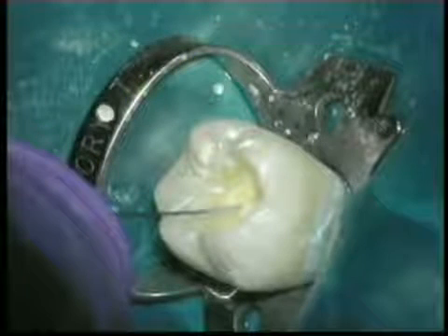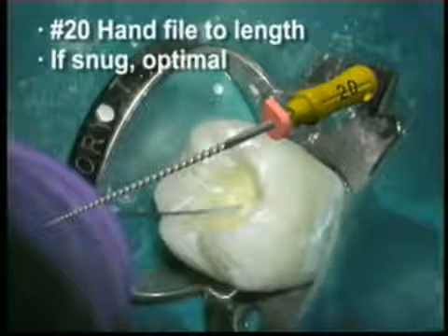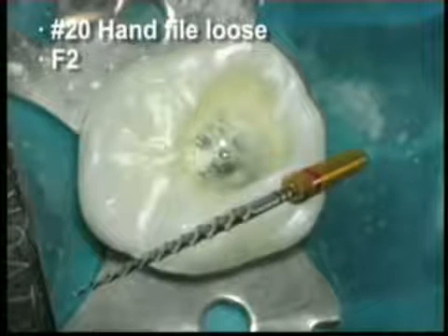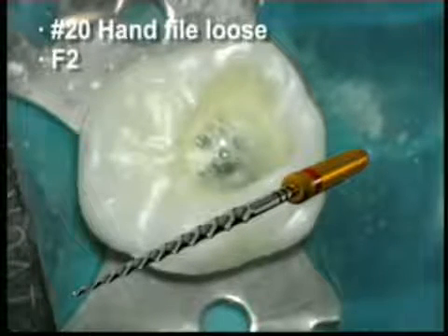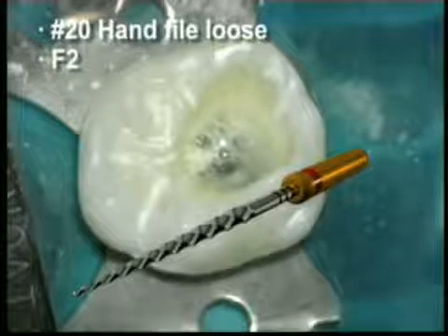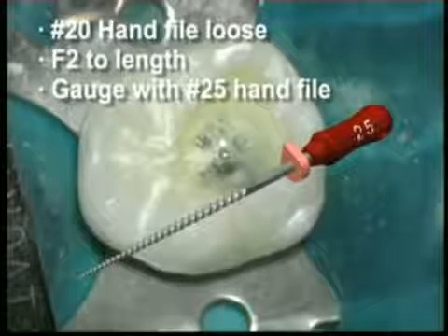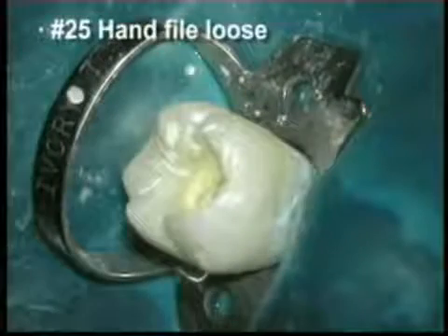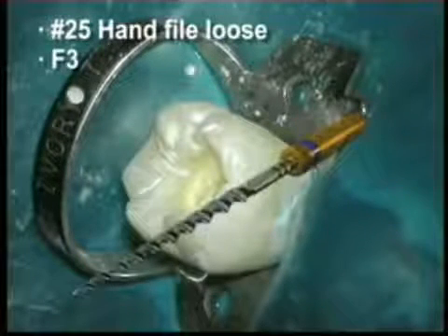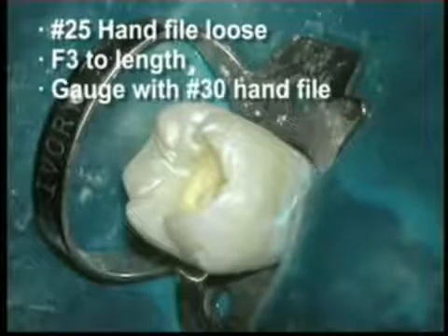Following the use of the F1, gauge the size of the foramen by dropping a 20 hand file to length. If the 20 hand file is snug at working length, the canal is optimally prepared and ready to obturate. If the 20 hand file is loose, proceed to rotary finishing file number 2, which has a red ring on its handle designating a tip equivalent to a size 25. With the pulp chamber filled with sodium hypochlorite, carry the F2 to length, then gauge with a 25 hand file. If the 25 is snug, the canal is finished and ready to obturate. If loose, proceed to finishing file number 3, which has a blue ring on its handle. Carefully carry the F3 to the desired working length and gauge the foramen with the 30 hand file.